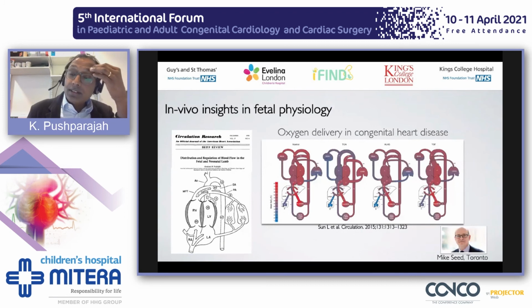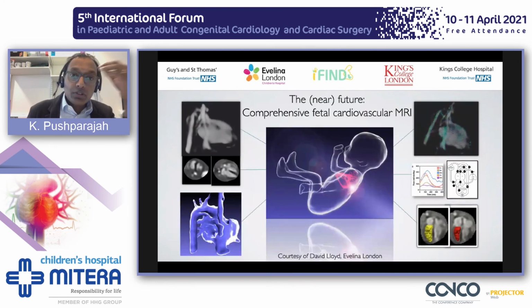A lot of insights in physiology, but this is at a research level, and we haven't got time to discuss it. But if you look at publications by Mike Seed in Toronto, this is where all the action's at, and it's really looking at the placental brain and cardiac axis in the fetus, and that has implications for all the interventions that we do. So in the near future, I think this is where we're going. We can get comprehensive fetal MRI, anatomy, function, flow, very much akin to what you get in postnatal life, and I think it's there. It's there.